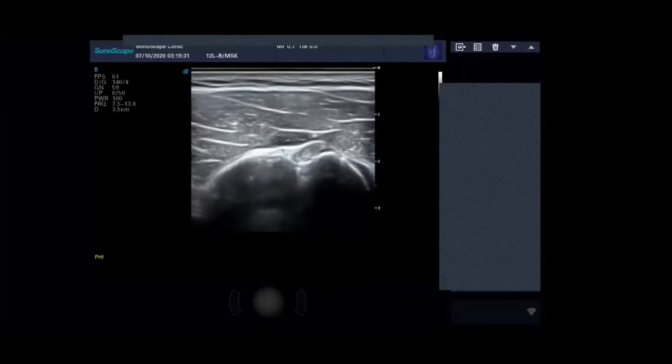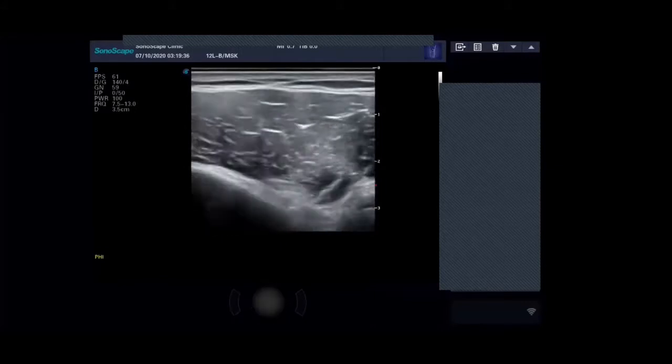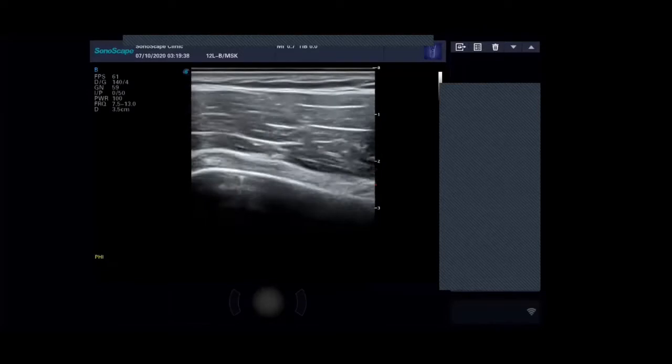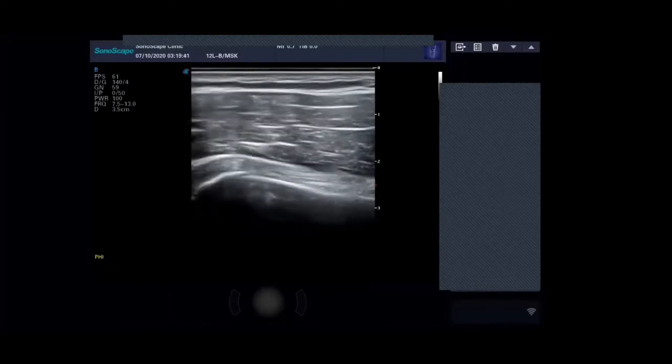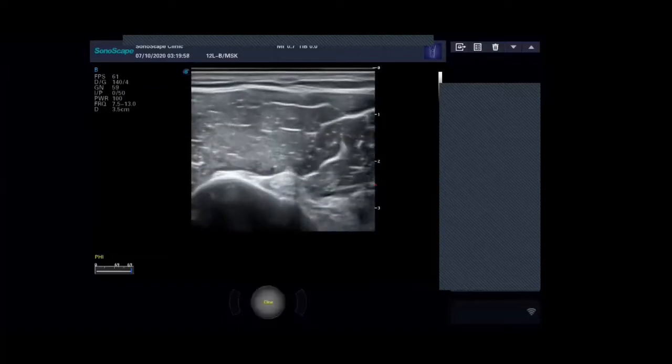Okay, split tears, you can probably see. They tend to get those in the biceps, and they're best viewed in the long section. So if I just long section this out here, what you'll get is a black line that goes through the center of this tendon here. And that can be indicative of a split tear. And then all you need to do is confirm it in the transverse view, and that will look like just a little black hole in the middle of the tendon.